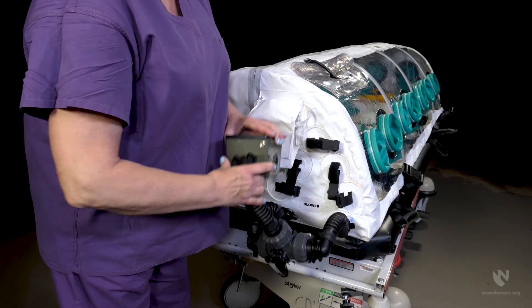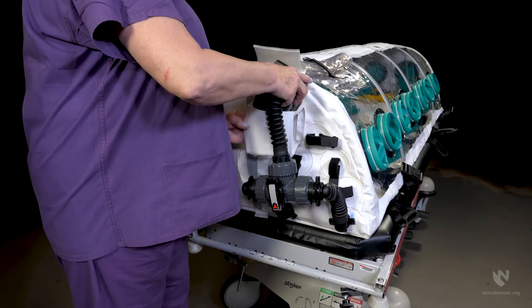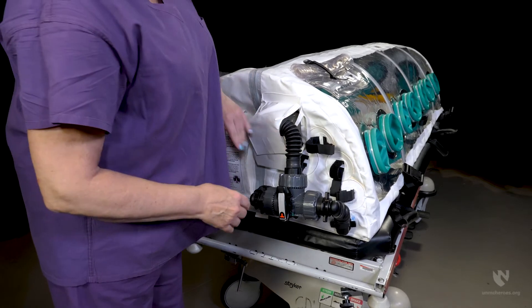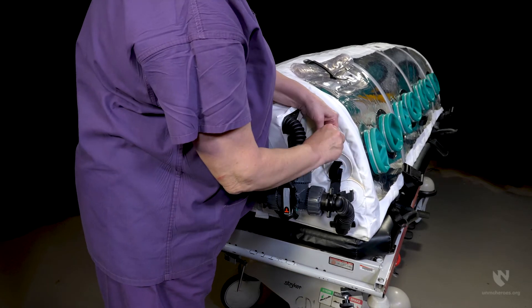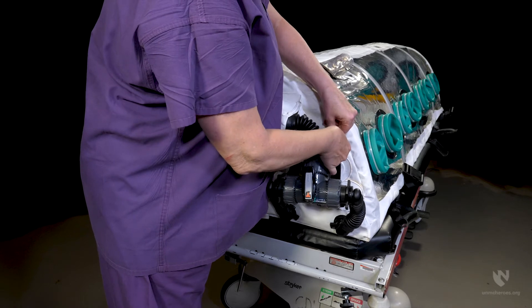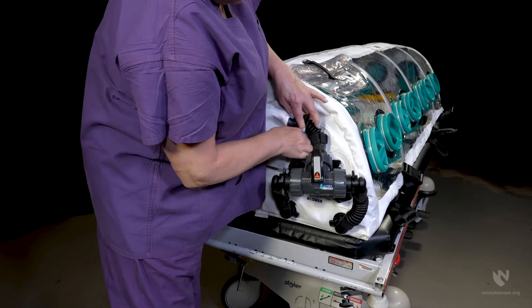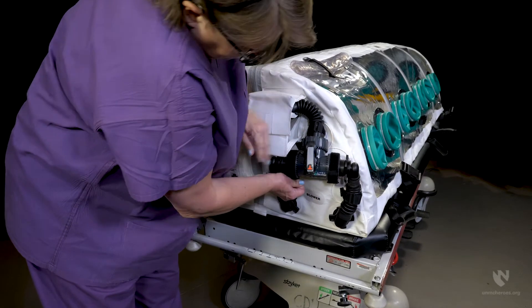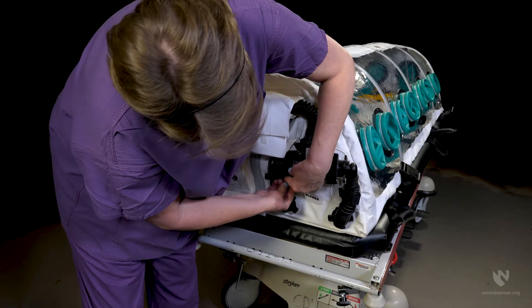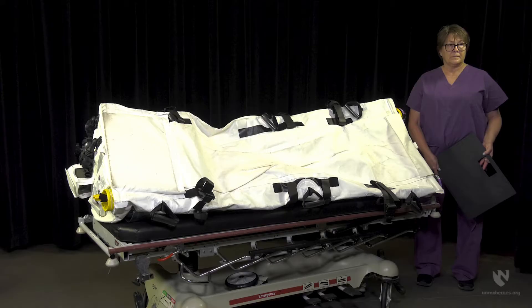Place the blower motor into the pouch with the male exhaust port facing down. Secure hoses to the enclosure with the hook and loop straps.